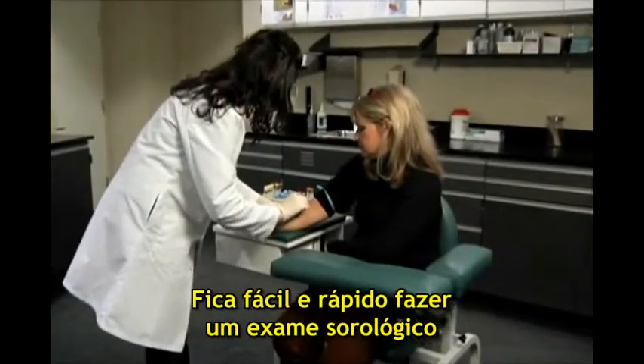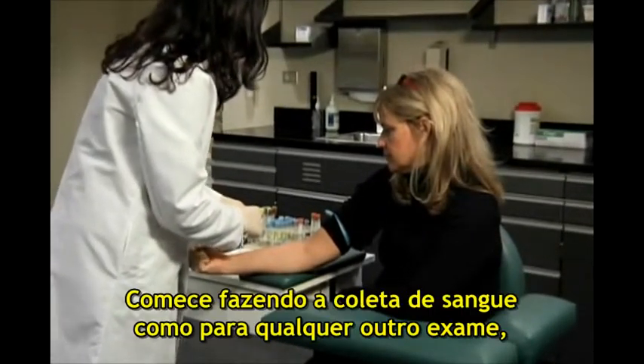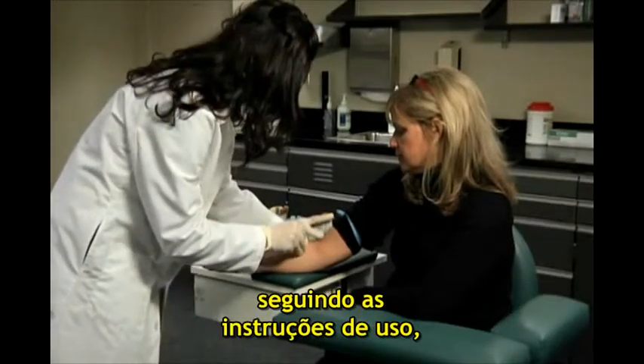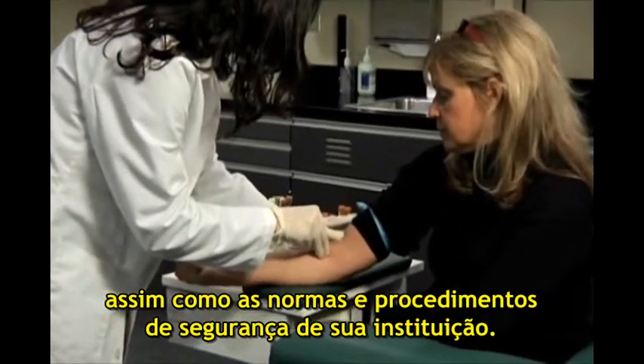It's simple to perform a rapid serum test using the BD VacuTainer Rapid Serum Tube. Start by performing a blood collection just as you would for any other laboratory test, following the package insert's instructions for use as well as your institution's policies and procedures for safe venipuncture.